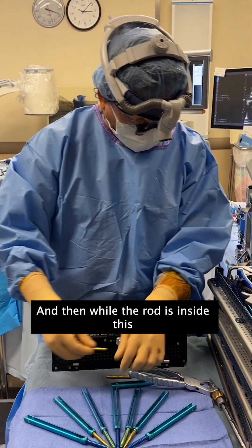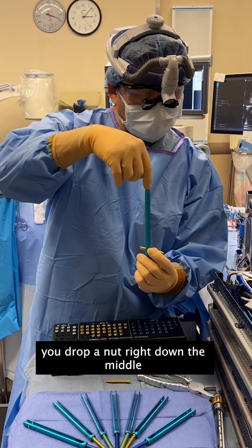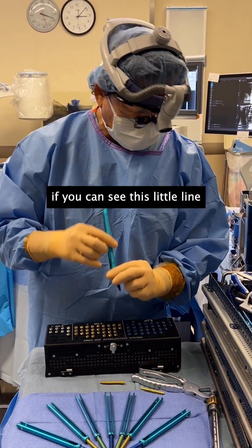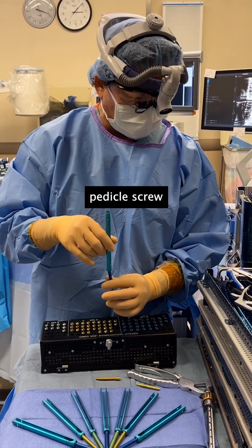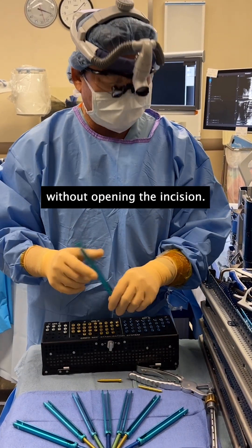While the rod is inside this rod sleeve, you drop a nut right down the middle and it locks it down. Then you break off these little tabs — and that's how you have a percutaneous pedicle screw all lined up, passing a rod without opening the incision.